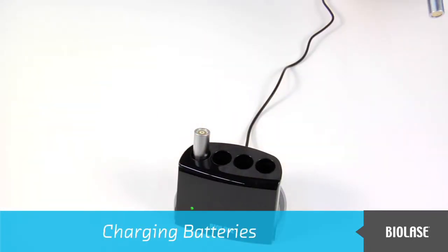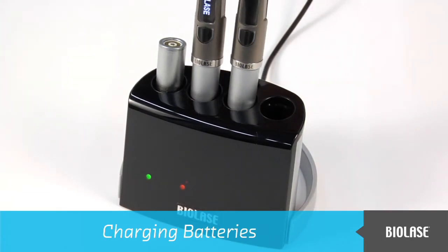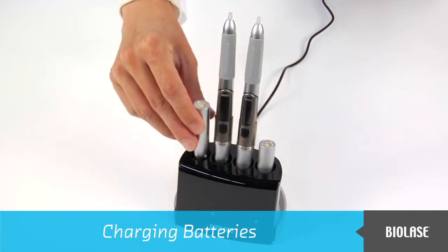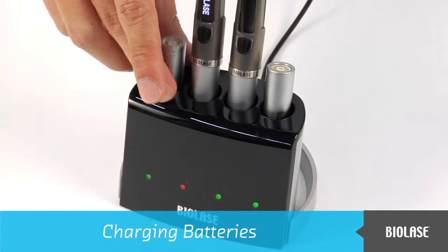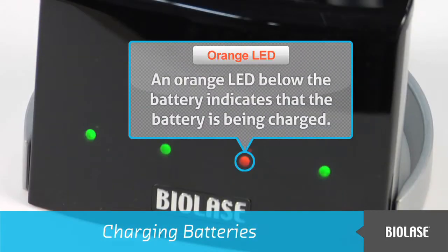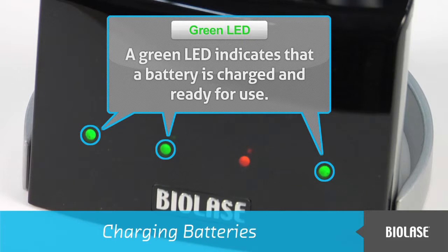Place the batteries into any of the receptacles. Up to 4 batteries may be charged simultaneously, whether or not an iLase handpiece is connected to it. Either side of the battery may be inserted into the charging station. There is no positive or negative side. An orange LED below the battery indicates that the battery is being charged, and a green LED indicates that a battery is charged and ready for use. It takes less than 1 hour to charge a battery.